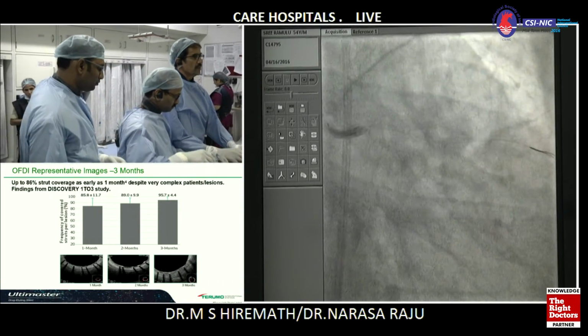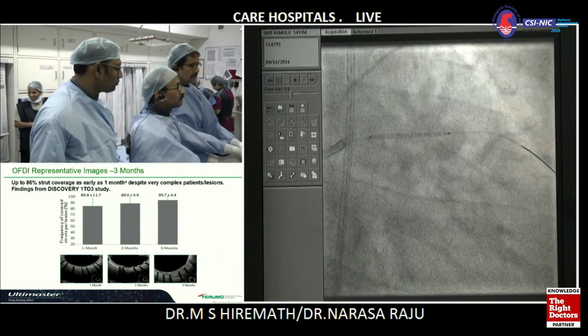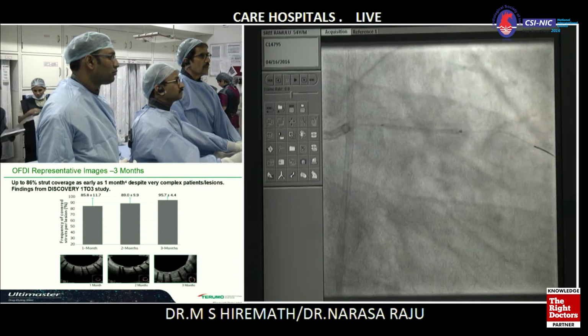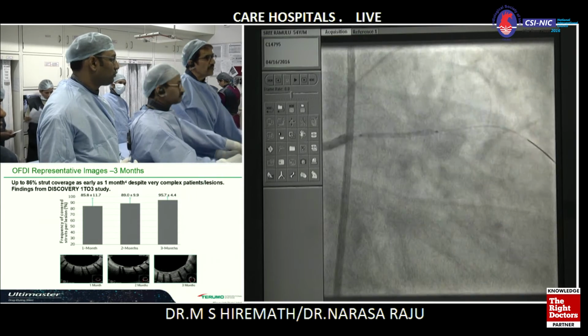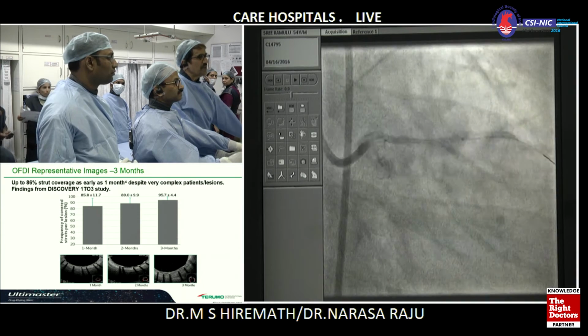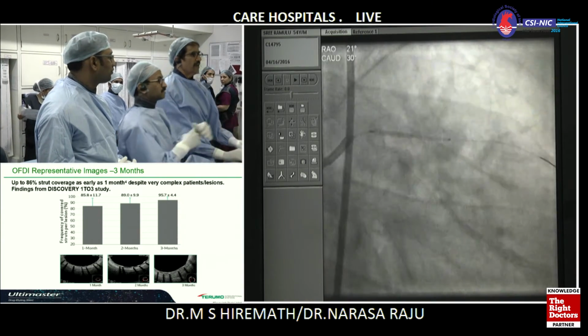Don't you think the 4 is a little extra for the bigger distal vessel, LAD? No, we saw the LAD. Or 3.5 or 3.2? So Rajiv, you arrived on the scene late. You should have told me earlier. I would have taken 3.5. Okay, it's 4.0.